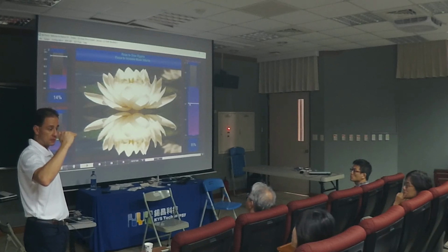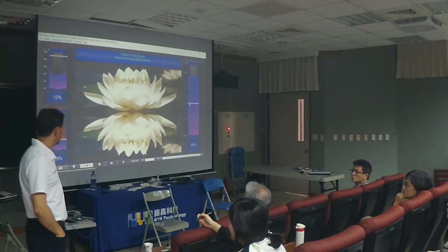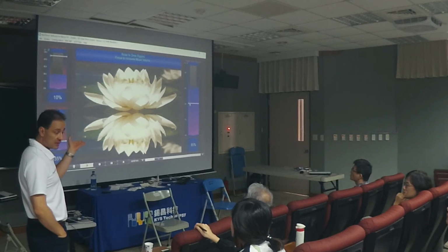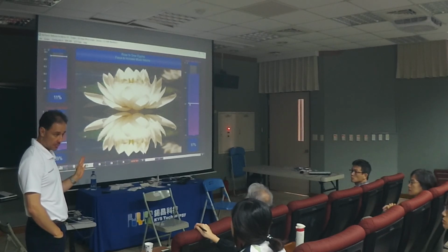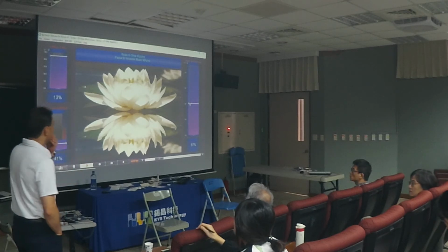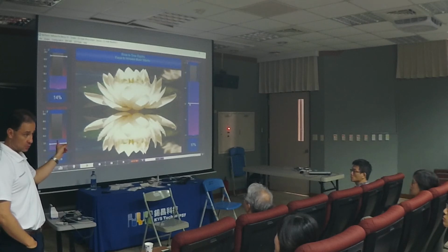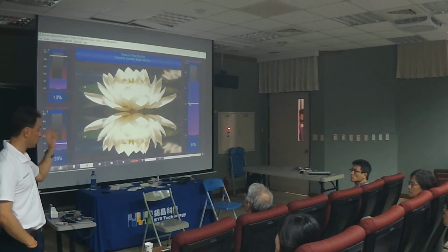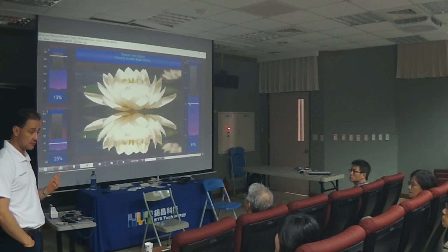Do you usually put so many bars on the screen? Well, this one has that many bars, and I will leave it like that. Sometimes I use 1 bar, sometimes I use no bars. Again, what we want is not for the client to be focused on the bars. What we want is for the client to be focused on the feedback, which is the water in this case. Okay? If the bars are too distracting for the client, don't use them.